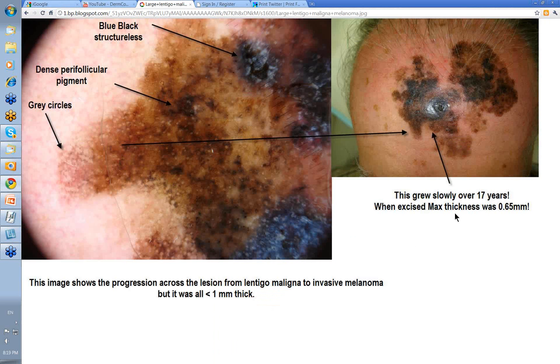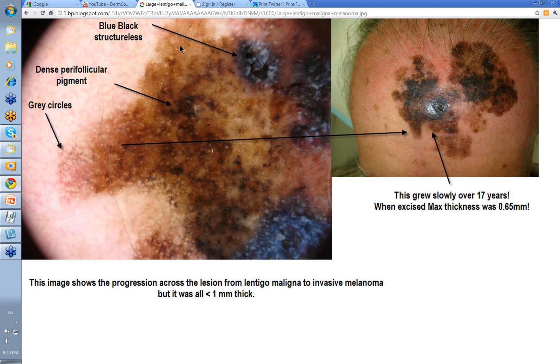Then you've got a case like this one. This lesion grew slowly over a period of 17 years. It had been biopsied initially and reported as a solar lentigo, and everyone believed that until it eventually reached this size and a new doctor took one look and said no. This portion corresponds to this area here — there are grey circles of early lentigo maligna, more diffuse pigment in between the follicles, dense perifollicular pigment obliterating the follicular openings, and a blue-black structureless area. It varied from lentigo maligna through invasive melanoma back to lentigo maligna, with maximum thickness about 0.65mm — all less than 1mm thick. He had the whole area excised with a graft and has been fine. It just shows you how slowly these lesions can grow before areas become invasive — 17 years.